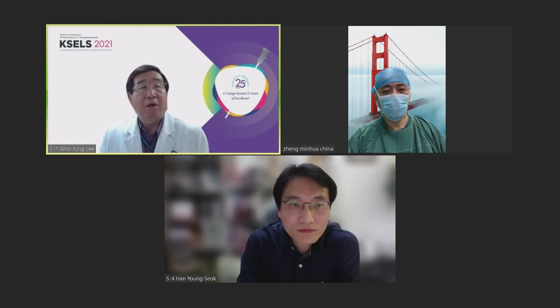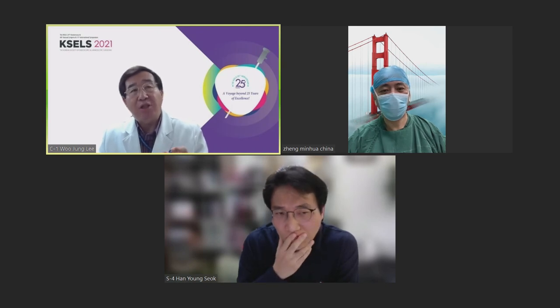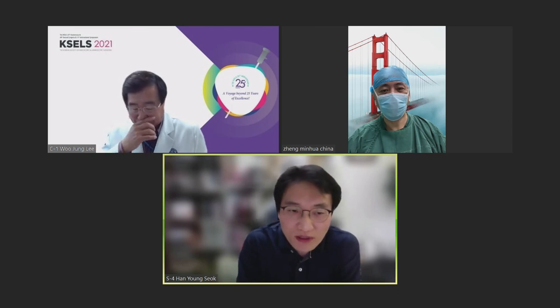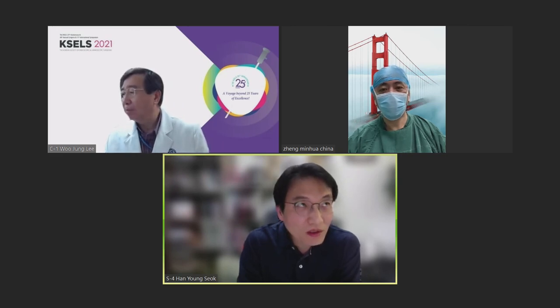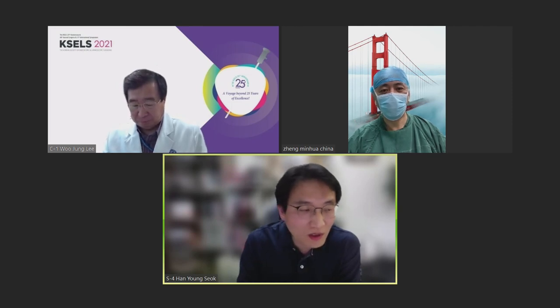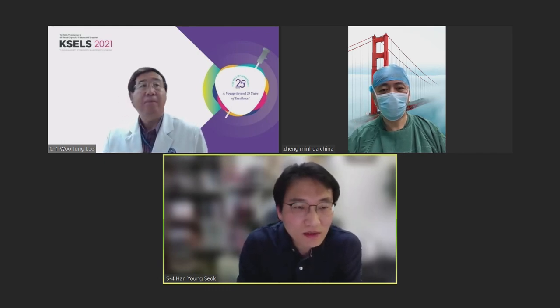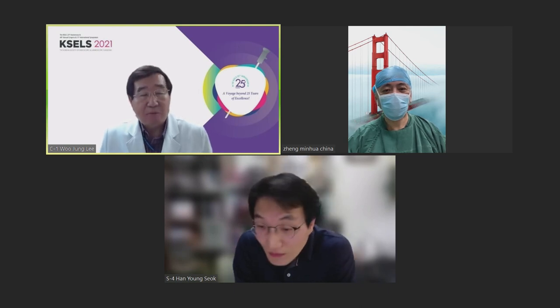Okay, thank you very much. Very good question and answer. And Dr. Han, one more question. Can you tell me exactly how many minutes before surgery you give the ICG? Okay, the injection time. In the ICG fluorescence technique, I think the injection time is a very important point. To confirm the exact bile duct image, I think 30 to 60 minutes. I inject the ICG 30 to 60 minutes before bile duct transection. Okay, thank you. Very good information. Thank you for your nice presentation.